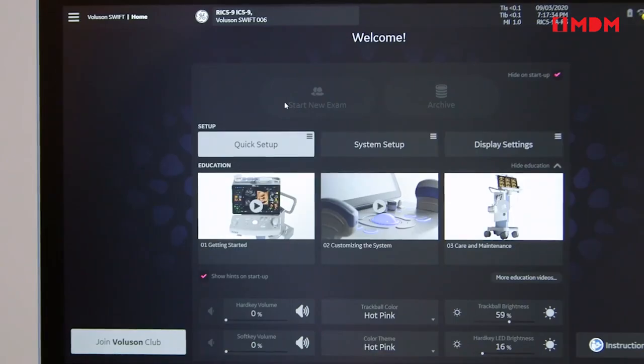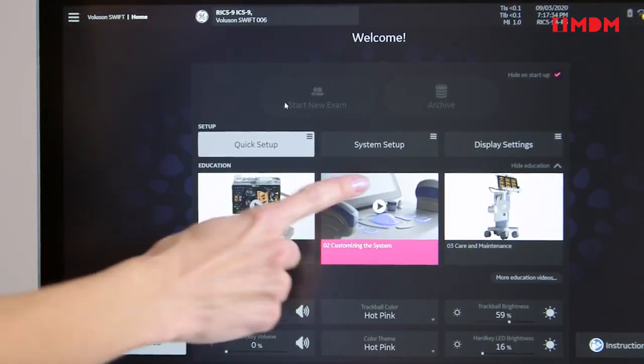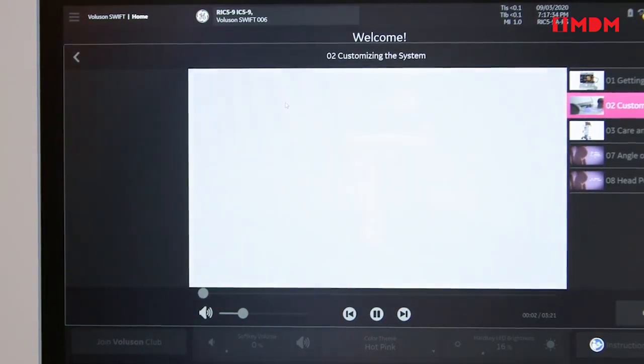On-board education videos are available in the home menu, allowing quick access to valuable training materials.